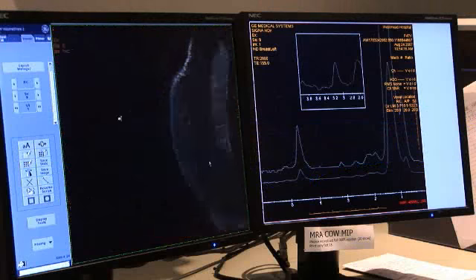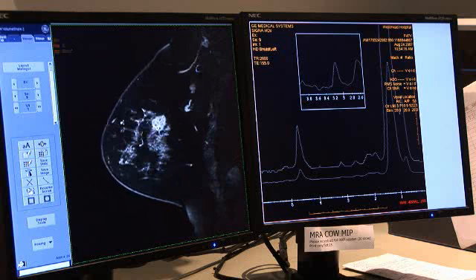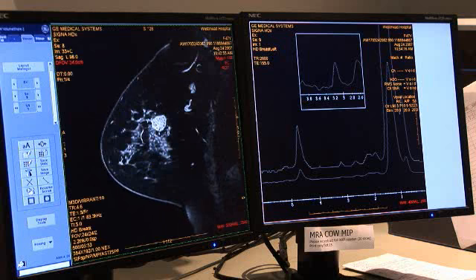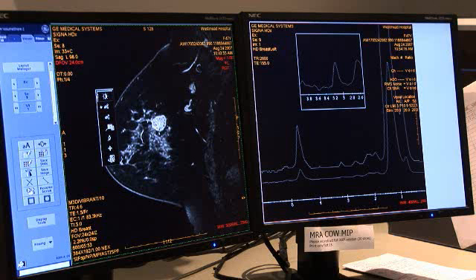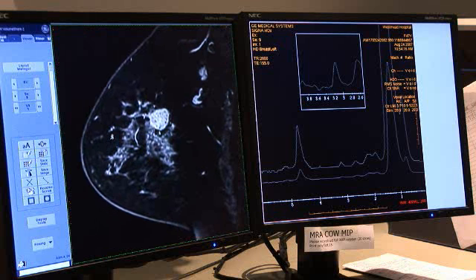Coming back to the human tissue, different tissue contains different amounts of hydrogen nuclei. For example, cancerous tissues are areas of rapidly growing and dividing cells. This increased cellular activity is accompanied by increased blood flow to the tissue and increased water content in the cells. As a result, a T2 weighted image will show cancerous tissue as an area of unusually high brightness.